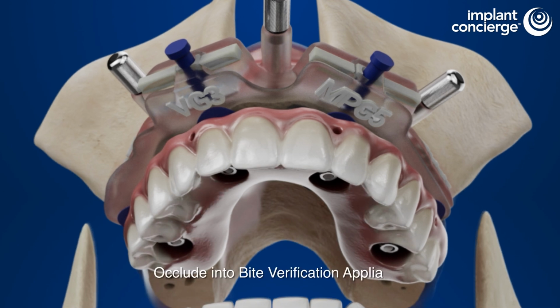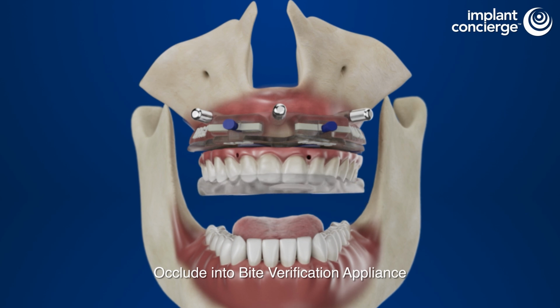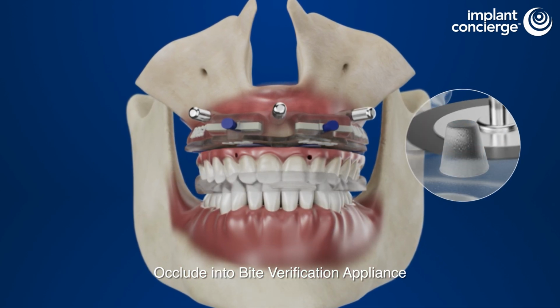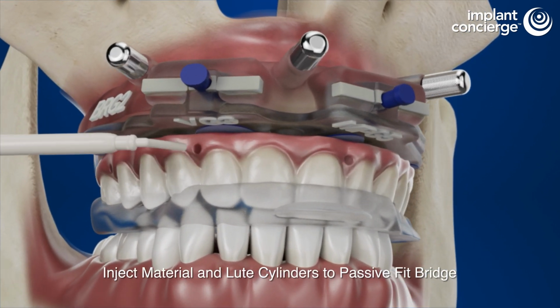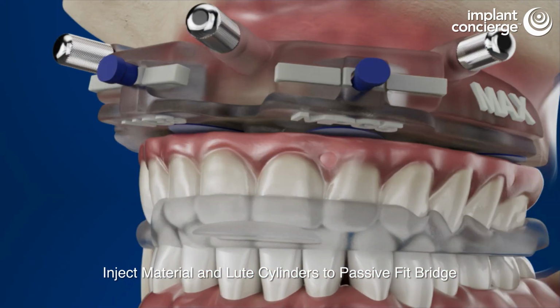Have the patient occlude into the bite verification appliance, ensuring the midline is in the correct position. If misaligned, remove the multi-purpose guide indexes to adjust the midline. While in occlusion, inject the material through the buccal holes to lute to the temporary cylinders. Repeat for each temporary cylinder.